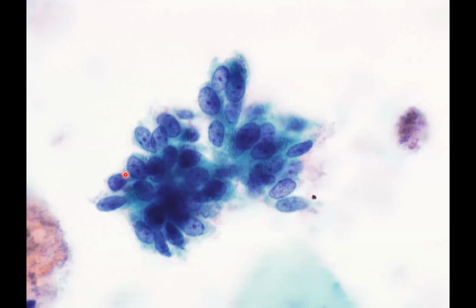Well, I can see some attempt at feathering and depth of focus, some nuclear elongation, although it's subtle, and the chromatin actually doesn't look too bad. So because I don't think I've got a full house of features, I probably would be marking that thinking, gosh, let me try and find something worse or something better. And if I was just left with this on my own, I think I would want to be on the safe side and call it borderline.